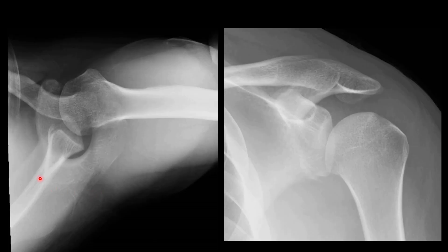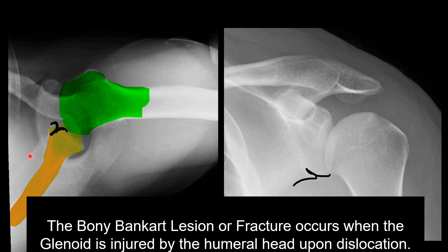Here are additional post-reduction films of a patient who suffered an anterior dislocation. On the left side, we have the axillary view where we are sighting up the patient's armpit with the glenoid here and the humeral head here. On the right side, we have an anterior projection of the shoulder, again with the glenoid and the humeral head. These images demonstrate another important finding that we can see in dislocation, mainly the bony Bankart lesion. The bony Bankart lesion is a fracture of the anterior portion of the glenoid rim where it's struck by the humeral head upon dislocation.